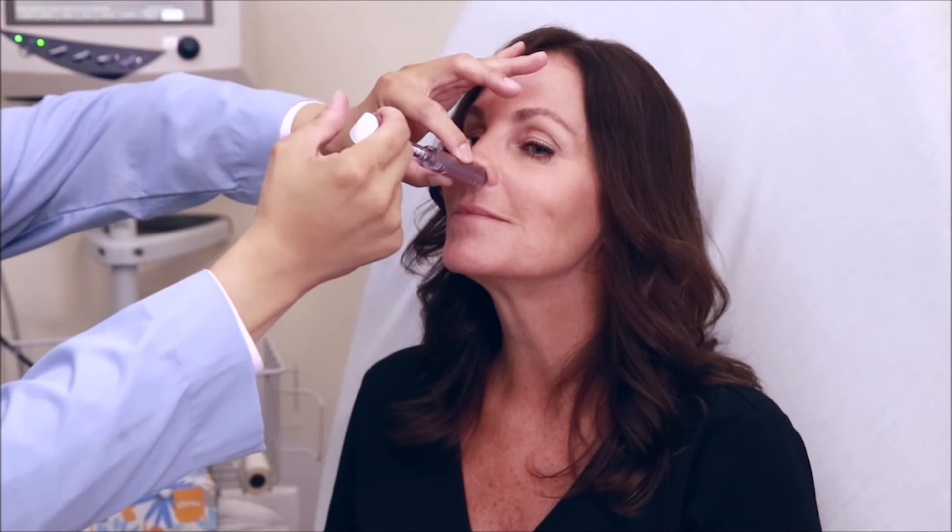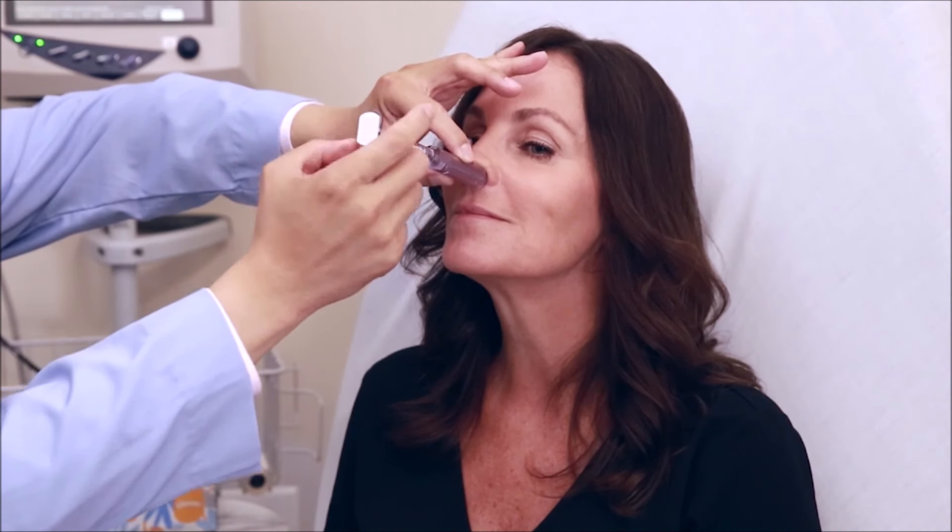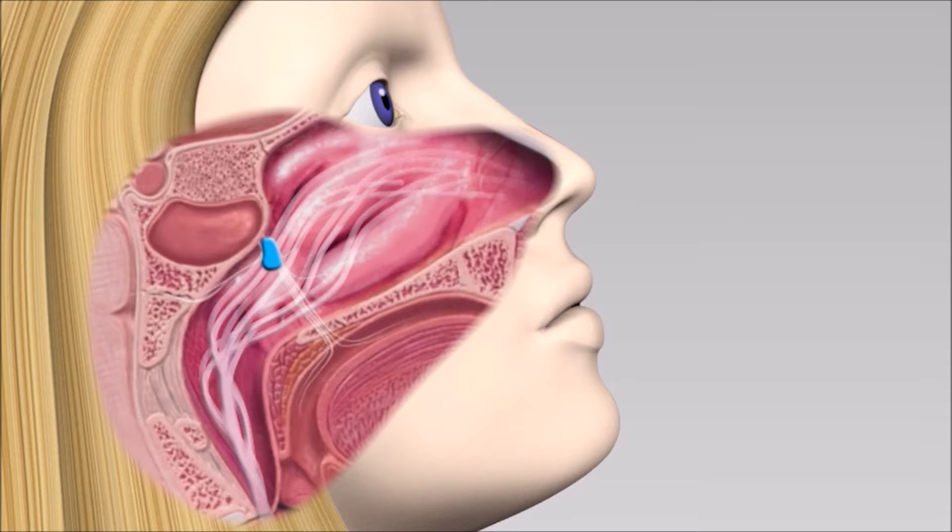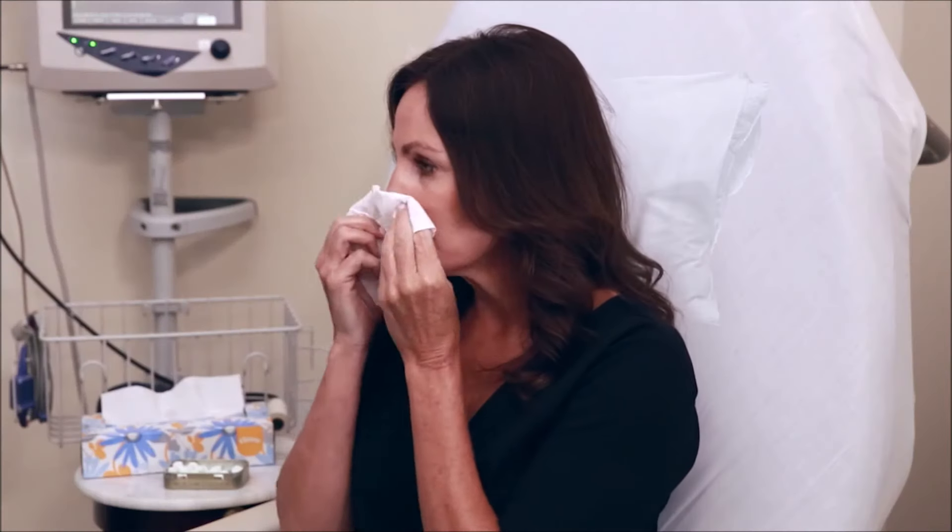Pull back on the syringe so the soft needle-like tip is back in place within the device and remove the entire apparatus from the patient with a swift move. Ask the patient to blow and to clear the left nostril. The entire process is very quick and painless.